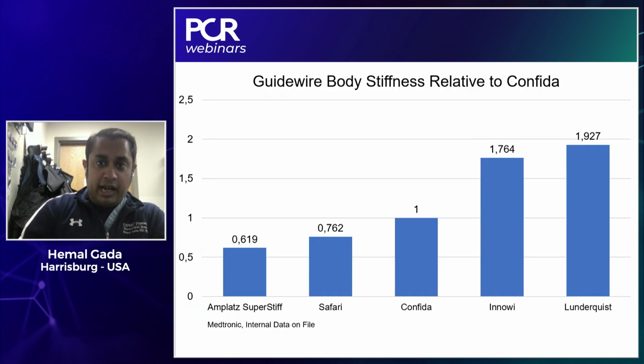So, the guide wire, I think, matters. We saw a pre-shaped guide wire in this particular case. I think with a 26 millimeter valve, it's less of an issue. But when you're dealing with a 29 or a 34 millimeter prosthesis, Mohammed made the point during the live case that he sees a lot of asymmetry in the valve from time to time between the non-coronary cusp and the left coronary cusp depth.